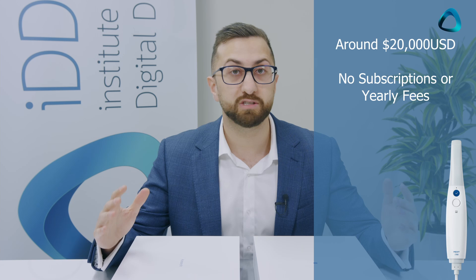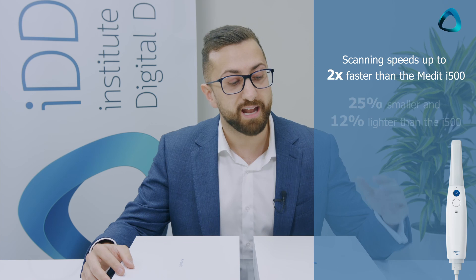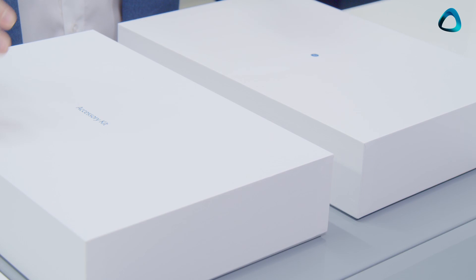Medit is also a company well known for its support and customer care. What they did with the Medit i700 — released just about two months ago — is really double down. They're pricing it at $20,000 USD, and again there are no subscription or yearly fees. The Medit i700 also promises double the scanning speed of the i500 and is 25% smaller. So without further ado, let's rip into these two boxes and see what we can find.